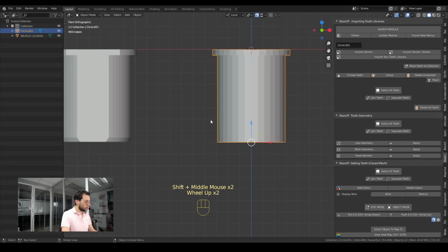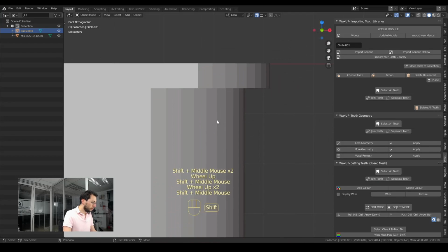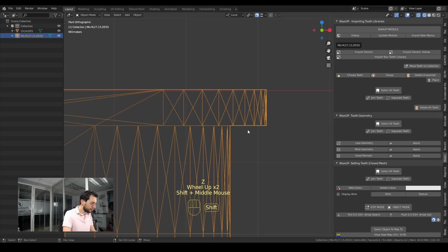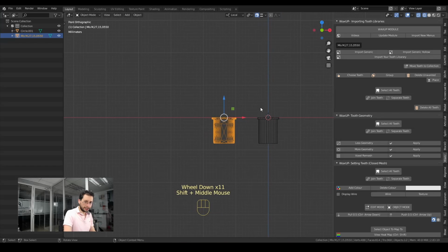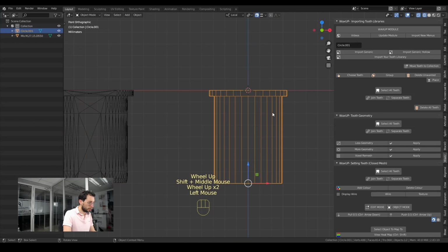However, it's just one single detail we have to take into account. If I examine this example, you may note that it is a little bit on top or over this red line, which means it's not flat with the X axis. It's not flat in the zero point of Blender.